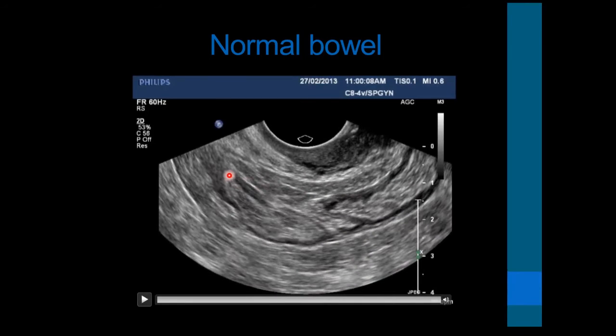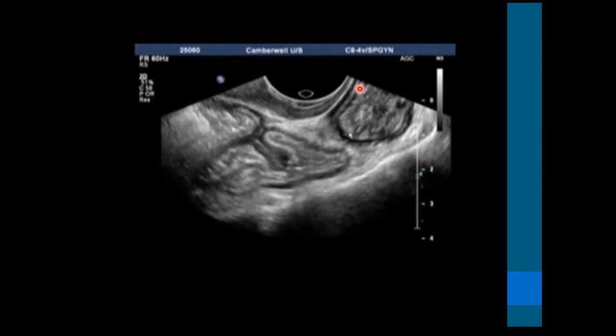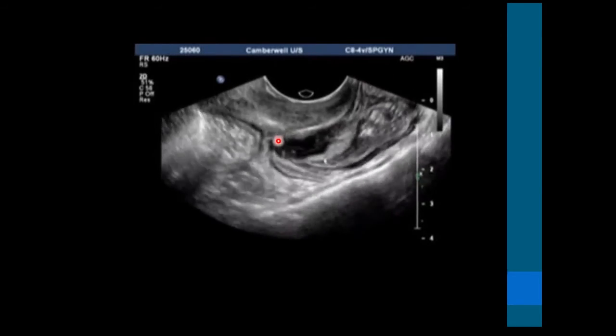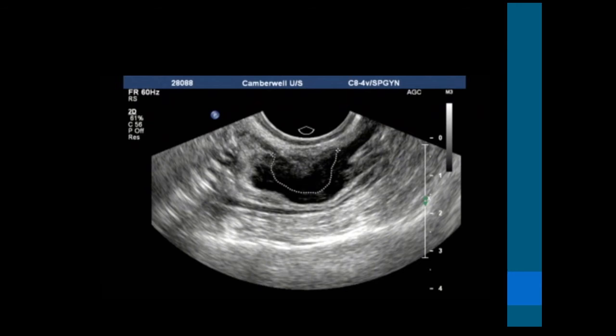And as I said, the majority of lesions will occur 15 centimeters maximum above the anus, but the free-lying loop of bowel lesions can occur a little bit further along. And you can see it more easily when you see this abnormal clip. You follow the muscle layer, and then suddenly there is this thickening, this hypoechoic nodule on the muscle layer, which is a lesion on the bowel. And this is just where it's stuck to the vagina. So this is a typical bowel lesion. But as I said, there are lesions on free-lying loops of bowel. Usually they have that shape where, particularly when they're bigger, they start to curl up on themselves.